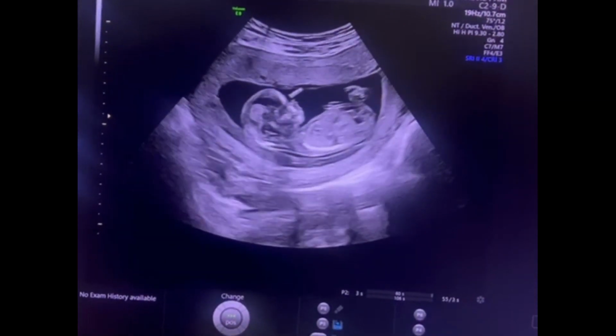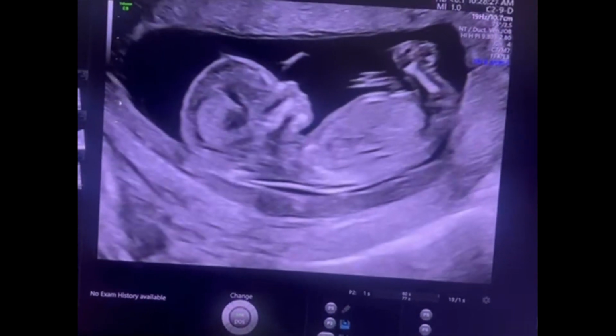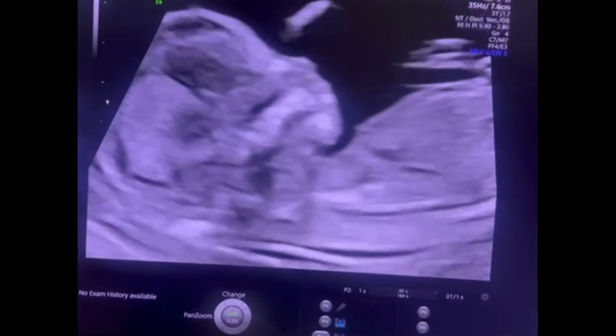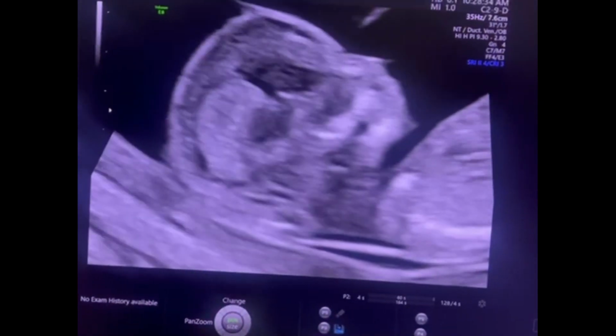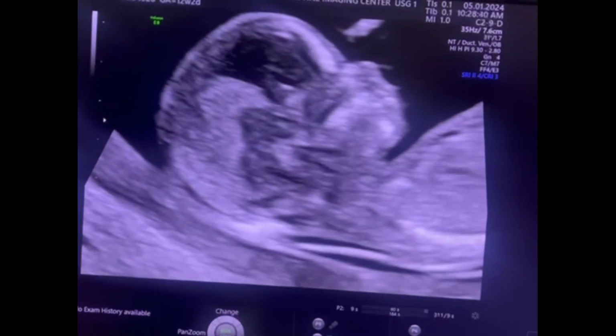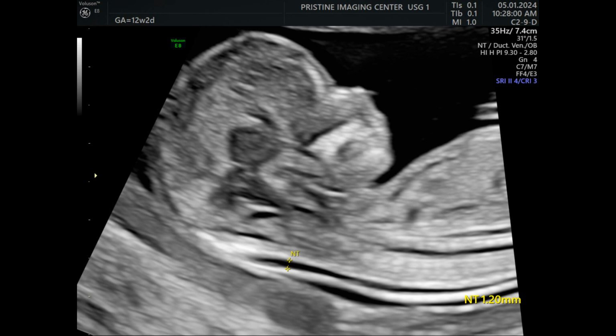So begin the scan. Now this is a small image. We magnify, then put the zoom box so that only the head and the upper part of the thorax is seen on the whole screen. Once we get an appropriate image, we freeze and we can see both the parameters, the nuchal translucency and the nasal bone, and the horizontal lines of the plus marks are placed exactly on the inner border of the nuchal translucency. And we also measure the nasal bone. Of course, nasal bone measurement is not required. It is only the presence or absence of nasal bone that is important.